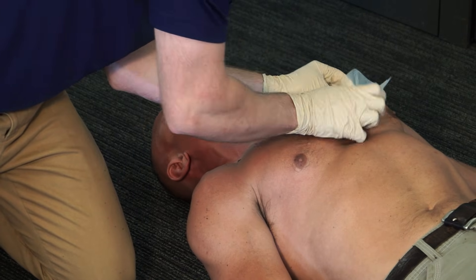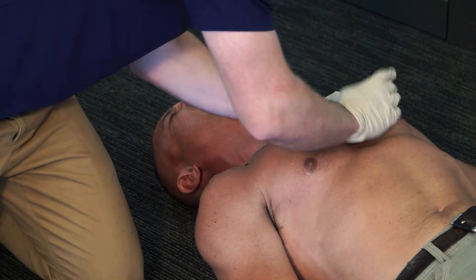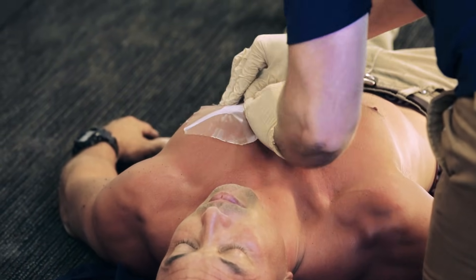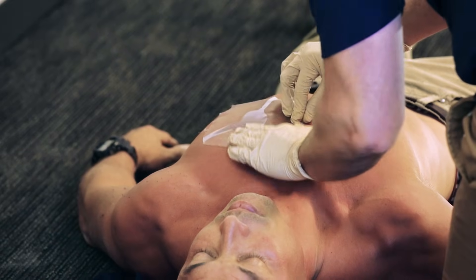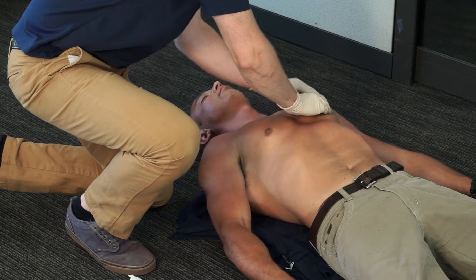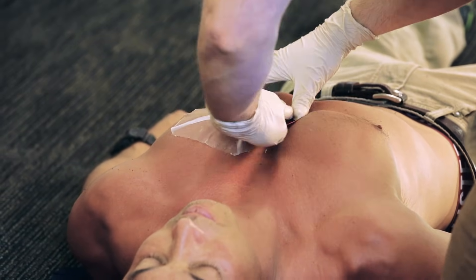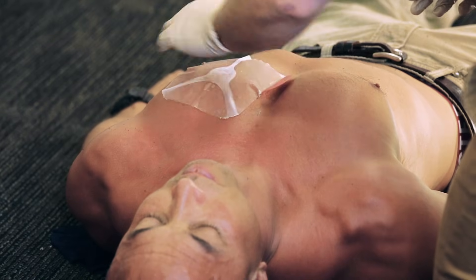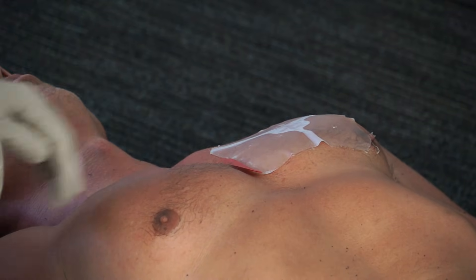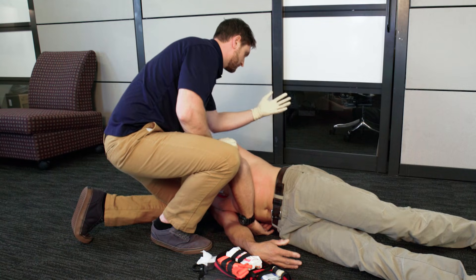Grip the red tab to peel the clear liner from the dressing. Now center the vent over the wound. Firmly press onto the skin for a good seal. It is very important to make sure you smooth out all edges flat against the skin.